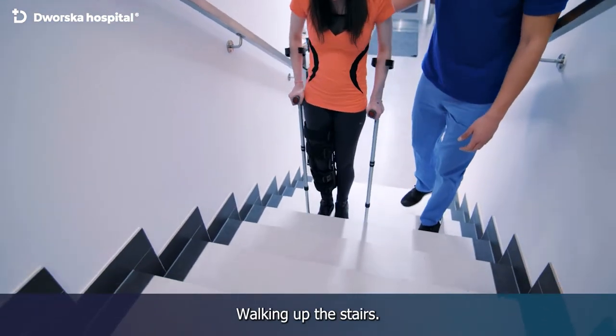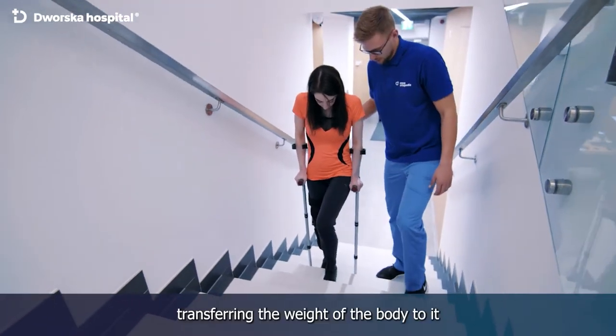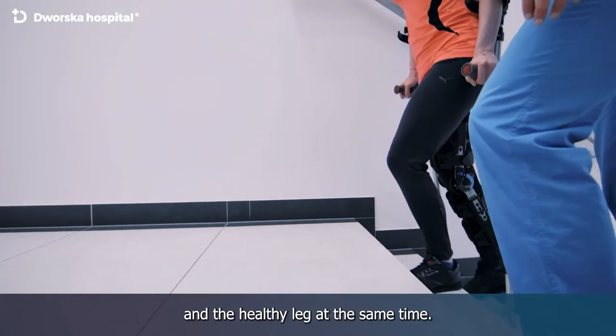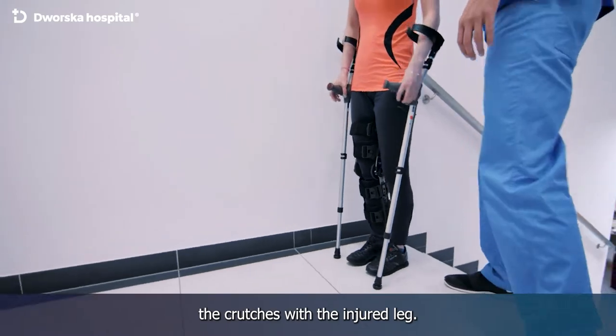Walking up the stairs: we step up with our healthy leg first, transferring the weight of the body to it and the crutches. We push off the crutches and the healthy leg at the same time, then step up simultaneously the crutches with the injured leg.